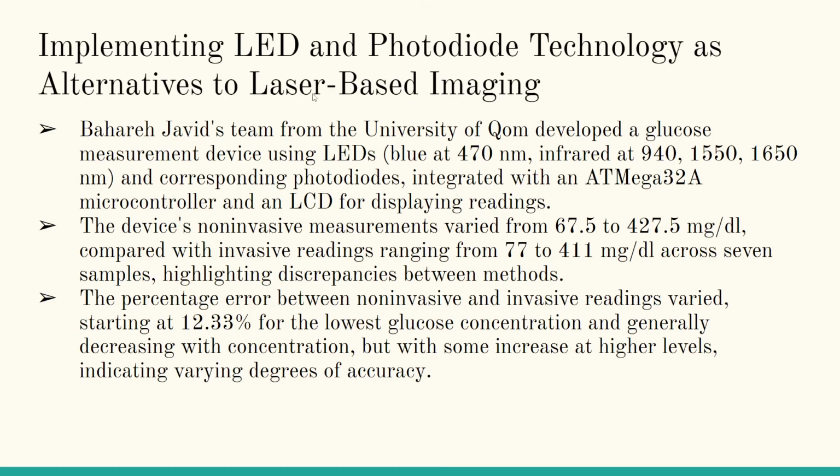So the next step in our research is using a 1600 nanometer LED light combined with photodiodes, and replicate these results and see what we can include from the physical factors to make a more informed and reliable machine learning model.